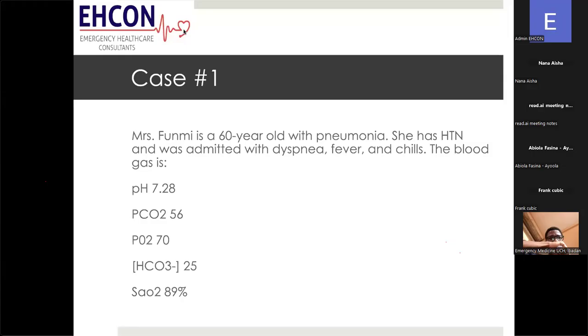It's still a valuable tool for us to use, but you should be aware that the pulse oximeter works by detecting the wavelength that's reflected off of the hemoglobin passing under the probe. Sometimes it has trouble doing that for darker skinned people. Like most things in the world, it's been calibrated for Caucasians, so you may find yourself with some really funny values. You should be cognizant of that possibility with your patients. Going right back into this case.